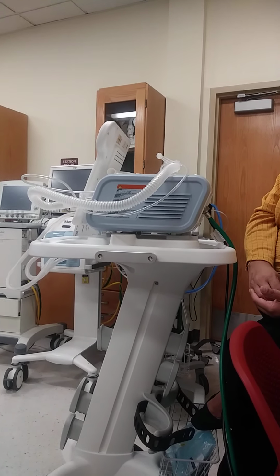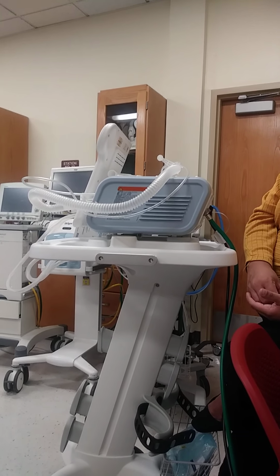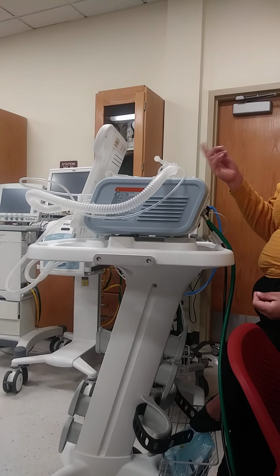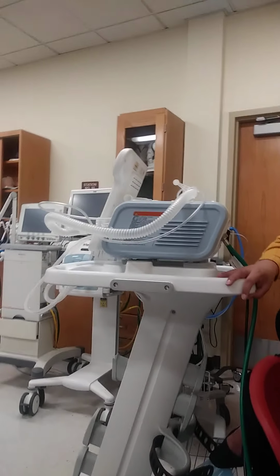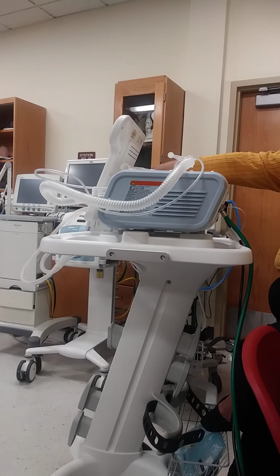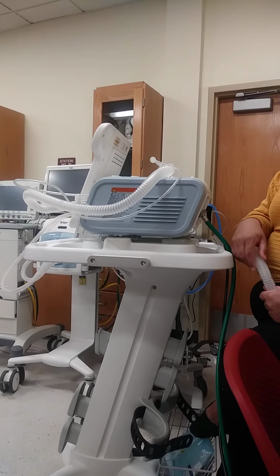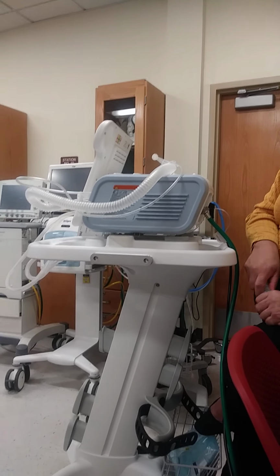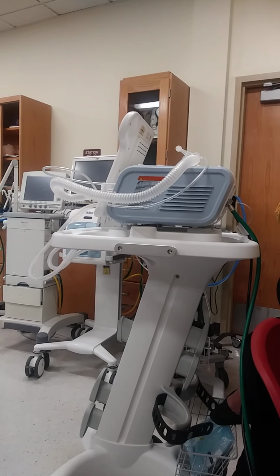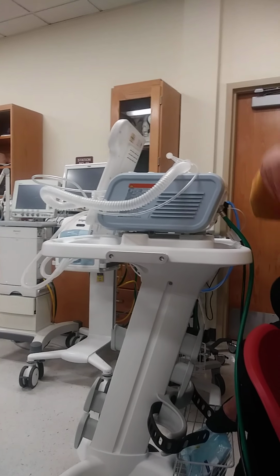Would you ever put a patient on this who just came off mechanical ventilation? Yeah, we do. That's a very good point. Patients who come out of heart surgery, like open heart surgery, the doctor says the sooner we get them off the ventilator, the better, because being on a ventilator is very high risk, and the longer you are on it, the harder it is to get off of it. So sometimes the doctors will tell us, they just had open heart surgery, extubate them, and then put them on BiPAP for a day or two, just to get them over that hump.